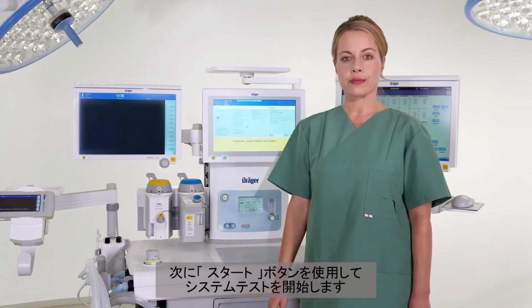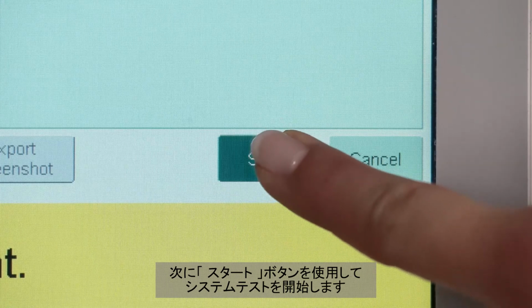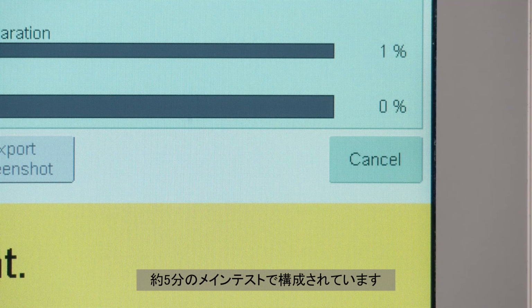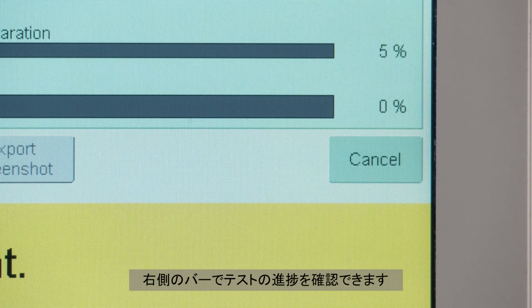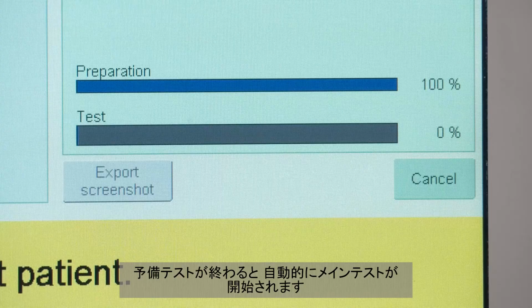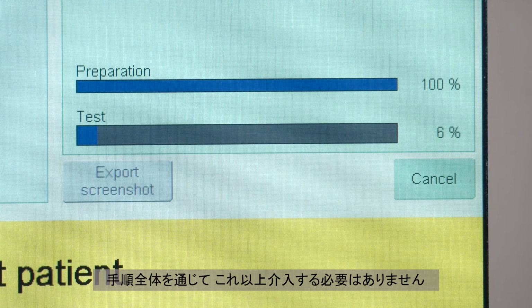Now start the system test using the Start button. The overall test consists of a pre-test lasting approximately 2 minutes and the main test, which takes about 5 minutes. You can follow the test progress on the bar on the right side. The device automatically starts the main test after completing the pre-test. No further intervention is required during the whole procedure.